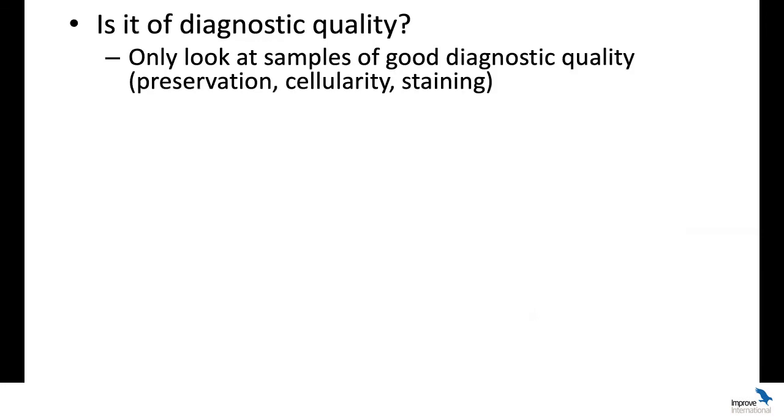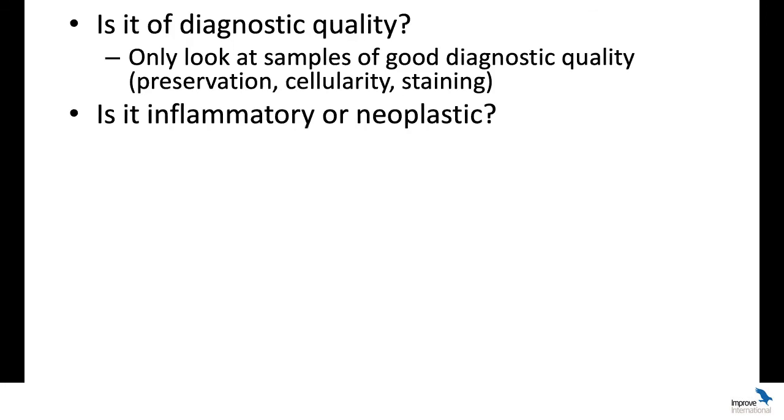So just a couple of reminders. The first question we need to ask ourselves is, is the slide of diagnostic quality? Only look at samples that are really of good diagnostic quality. They have lots of cells to look at, the cells are well preserved and they're well stained. If not, again, make it someone else's problem, or even better, go and collect a new sample.